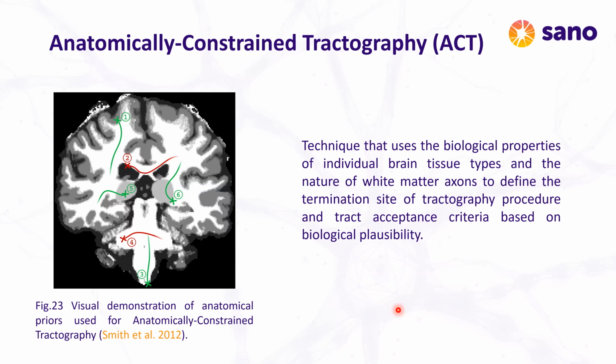For this reason, it is beneficial to use prior knowledge about the anatomy of the brain and structural information to guide the tractography procedure. However, generating only simple binary masks, for example, defining the white matter regions in the brain, makes very little use of the available anatomical information.